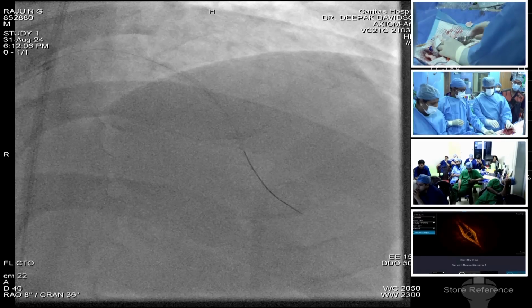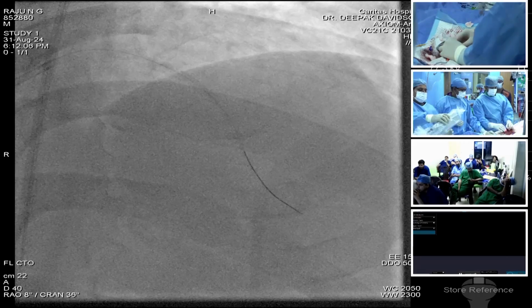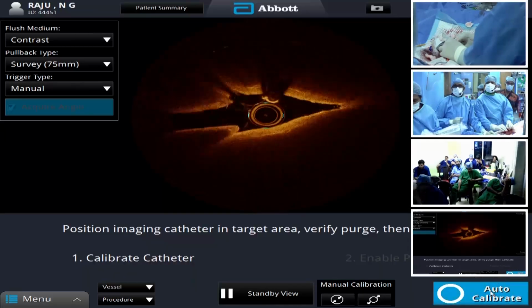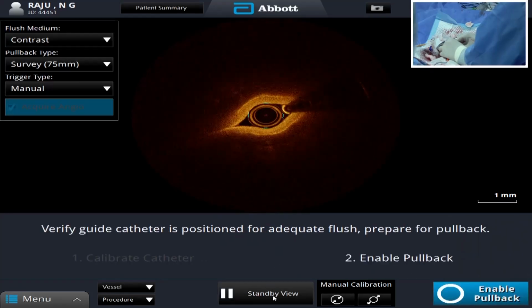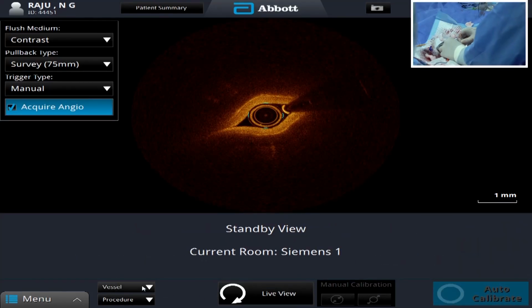Okay, that's good. Fisheye. Okay. Yes, auto calibrate. Okay. Is this a New York catheter? OCT?